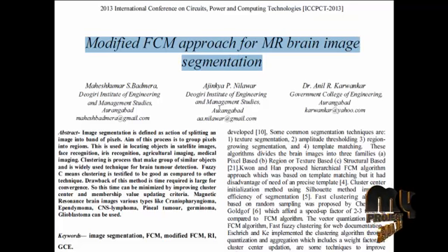The quantization of the feature space is performed by masking the lower m bits of the feature value. The quantized output will result in common intensity values for more than one feature vector. In the process of aggregation, feature vectors which share common intensity values are grouped together. A representative feature vector is chosen from each group and given as input to the conventional FCM algorithm. Once the clustering is complete, the representative feature vector's membership values are distributed identically to all members of the quantization level. Since the modified FCM algorithm uses a reduced dataset, the convergence rate is highly improved when compared with the conventional FCM.